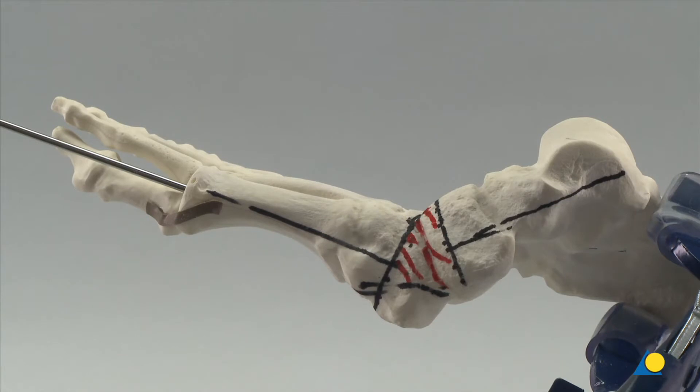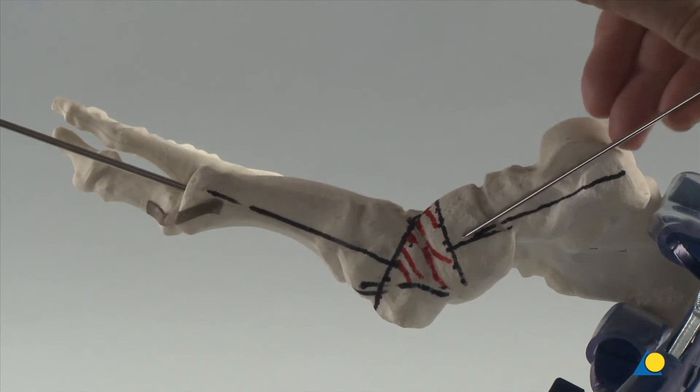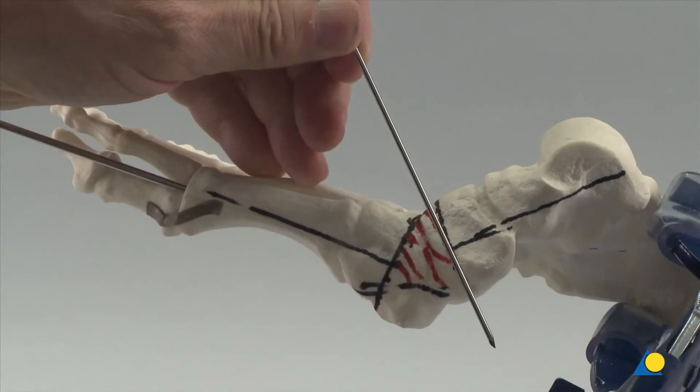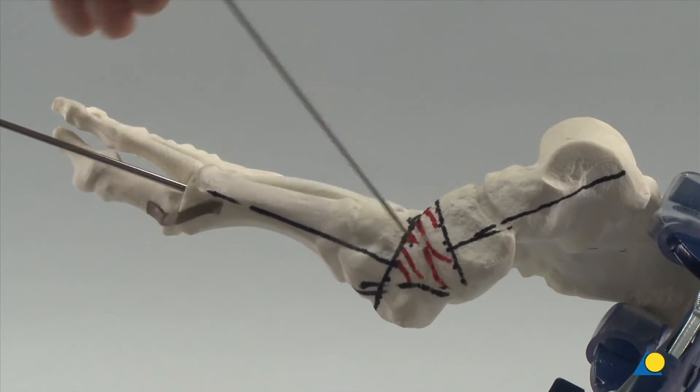Viewing from medial to lateral, the deformity can be seen. The normal axes of the first metatarsal up to the talonavicular joint level, as well as the talonavicular segment, have been marked on the model. The resection planes perpendicular to these axes are planned, and the amount of resection is visualized by marking the bone to be removed in red.